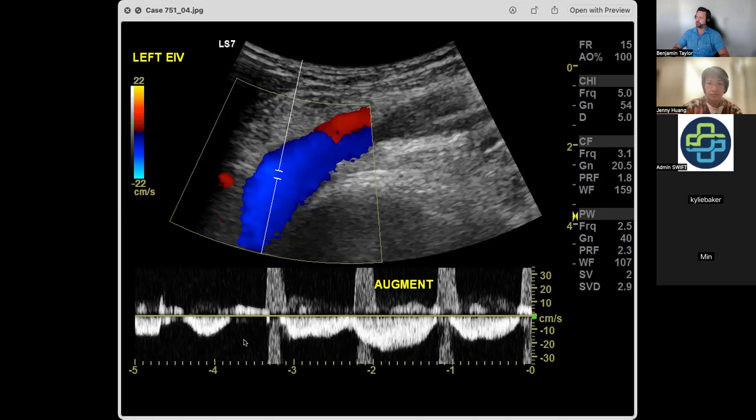You certainly can. The way I think of this is, somebody down there has squeezed the calf. So what we hope to see is a calf full of blood in all the veins. Somebody squeezed it, and you have a big squirt of blood going up through the vessels.